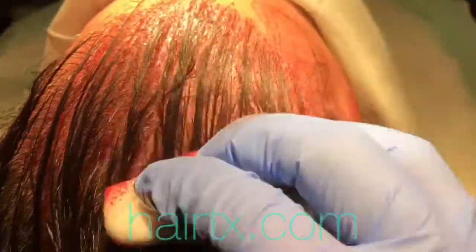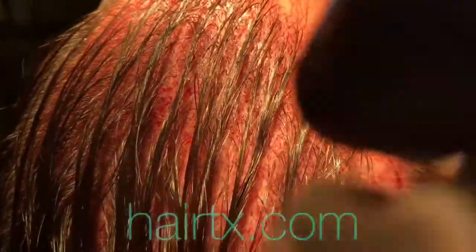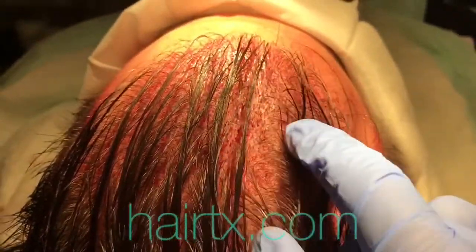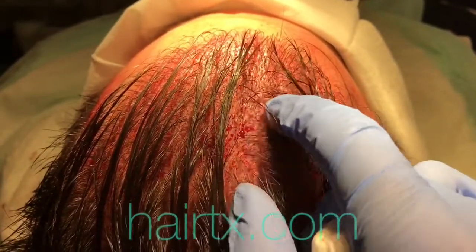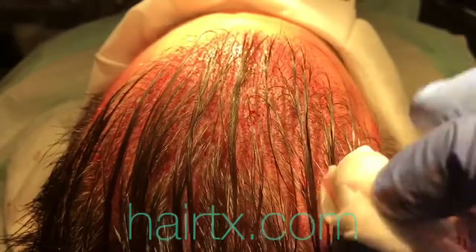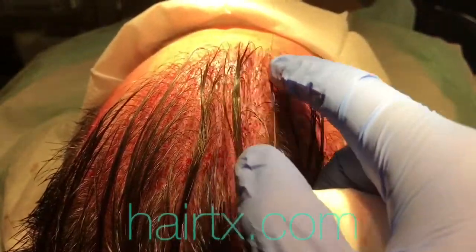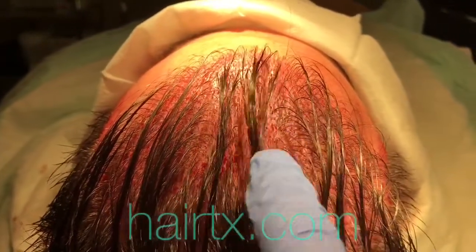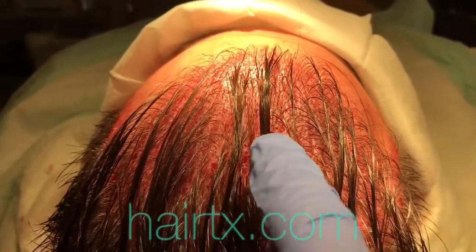We just completed this Megasession hairline correction and temporal point procedure on this gentleman. He's had a couple procedures in the past where the problems were that there were trifollicular and tetrafollicular unit grafts, which meant they're very large grafts. There weren't plugs, they're smaller than that, but he had a hard time combing it because the angles were erect going up this way. He had some 2-hair grafts along the hairline, and also they were so scattered out that it looked grafty. So we wanted to make this look more natural.